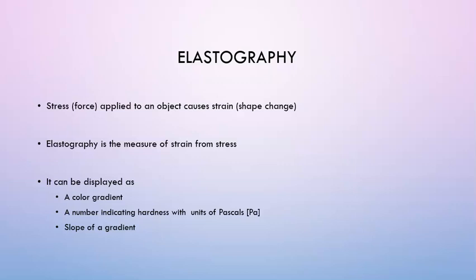So elastography is the measure of strain from stress. It can be displayed as a color gradient, a number indicating the units in pressure, the slope of a gradient in a specialized case that we'll go into.